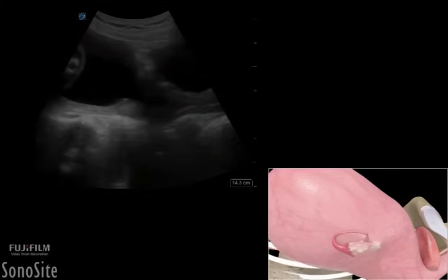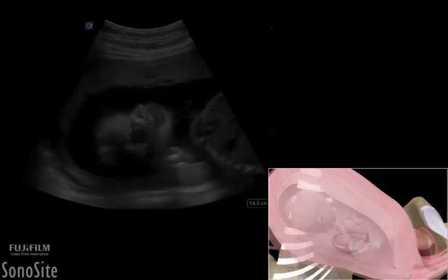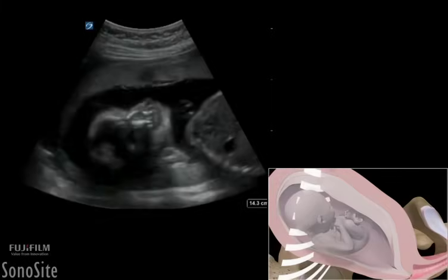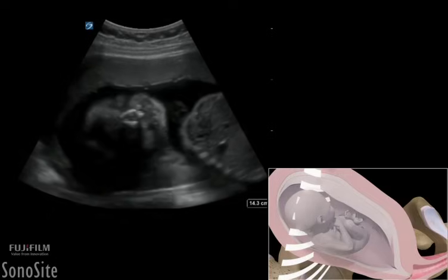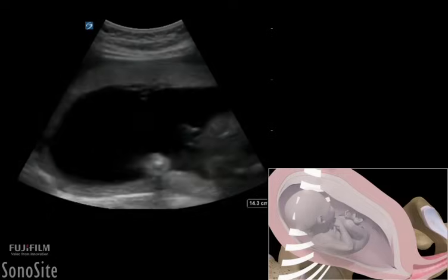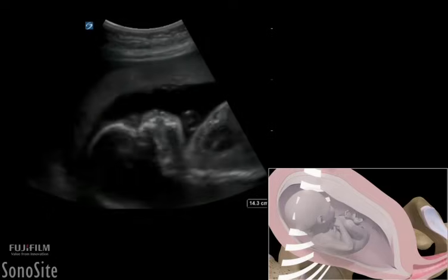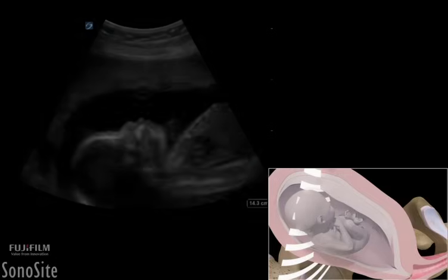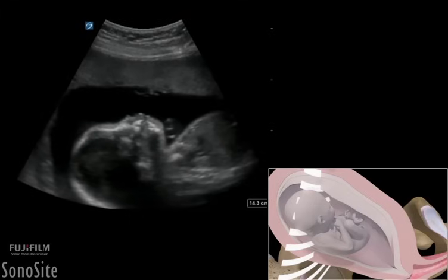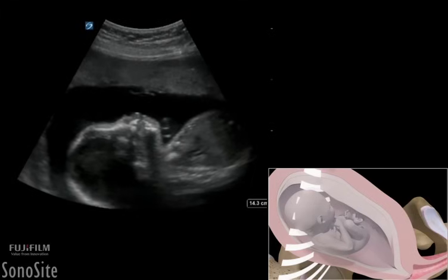The transducer is then rotated to a transverse orientation with the orientation marker directed to the patient's right to perform a systematic fetal survey to identify the fetal structures.